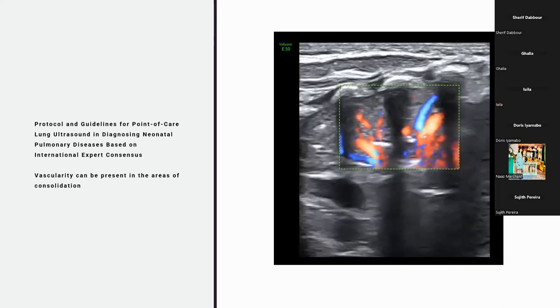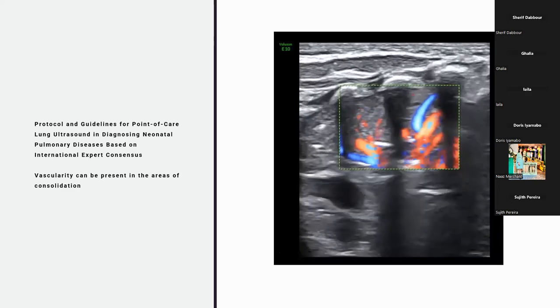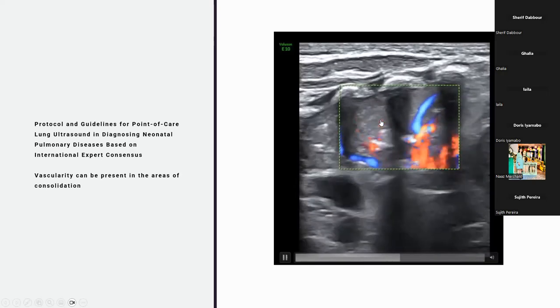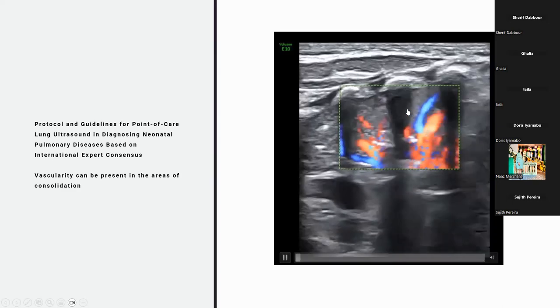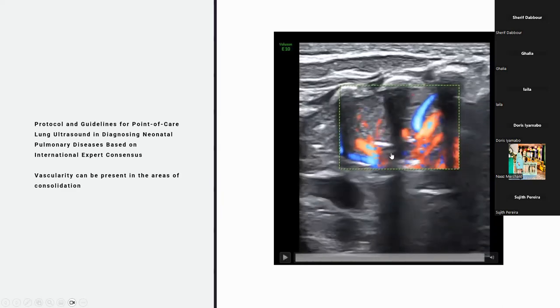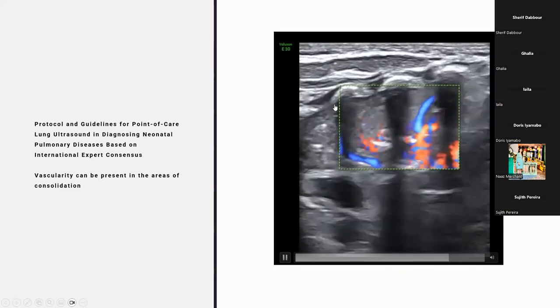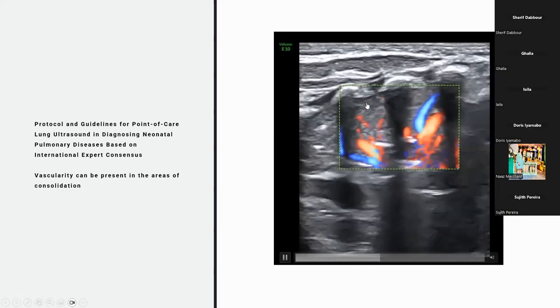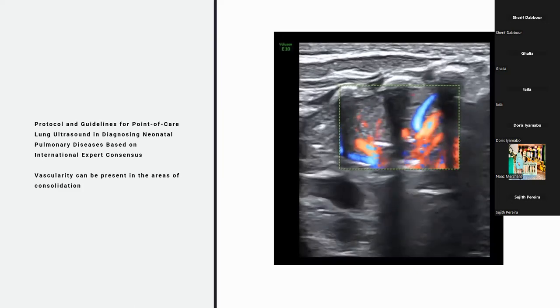I think if your clinical markers were completely normal, and let's say this is a 25-weeker who's 16 days old, who has a slight increase in oxygen requirement, looks clinically well, and you pick this up, and this is the left lung, then this is what I want to raise with you: that dictum that just because you have increased vascularity, this reflects consolidation. Well, this is probably a mix of consolidation in the bottom area with parallel air bronchograms, which is quite vascular because it's healing. But clearly, because you can't see the pleural line, there's an element of atelectasis distally, but it doesn't have very well vascularized margins because the lungs are collapsed. So can you see how it can get very confusing? And what is very, very important is that you clinically correlate.